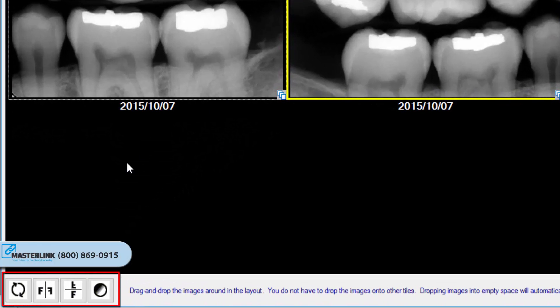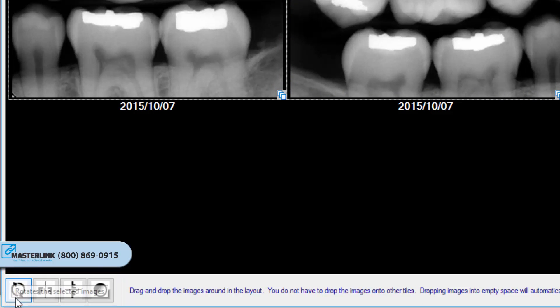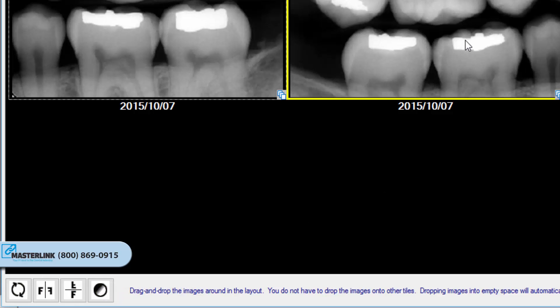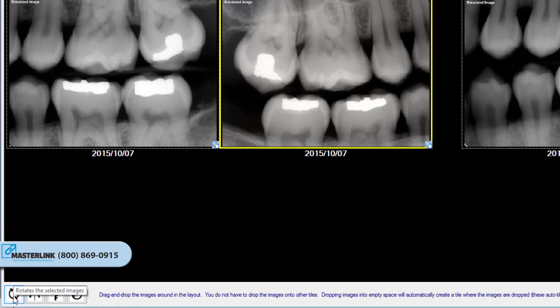Your enhancement buttons are the buttons in the bottom left of the capture layout window and are used to rotate, vertically and horizontally mirror, and invert images in the layout. These buttons are most commonly used with phosphor plate scanners, as tiles may be scanned by the user in random order and rearranged after capture.